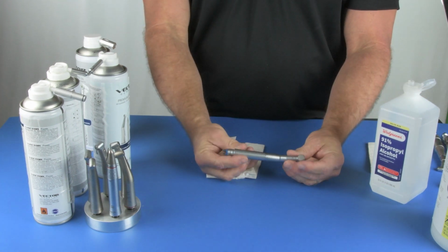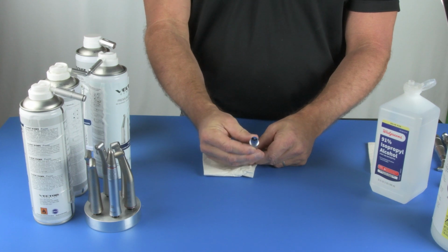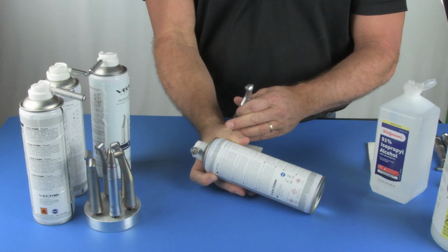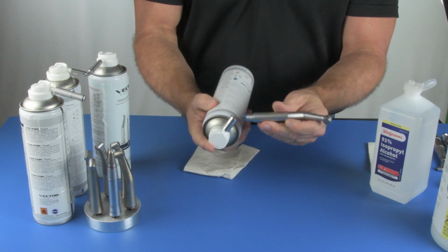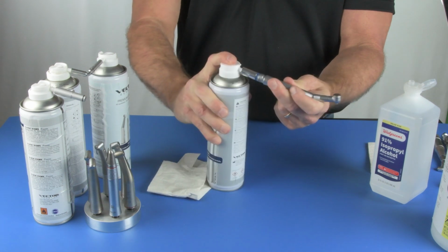There are also this type of high-speed handpiece, which has the tubes coming out the back end with screw down, or screw down type is what we call it. This takes a special adapter that is only for those generally. It has built-in holes so you cannot misline up the handpiece. These are the best type of adapters to use so you cannot lubricate the handpiece incorrectly.